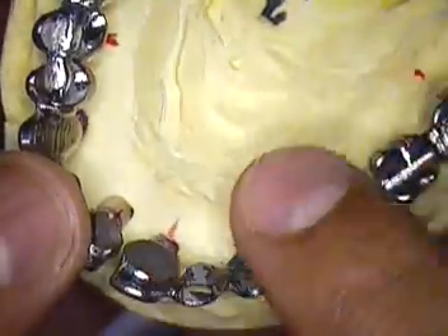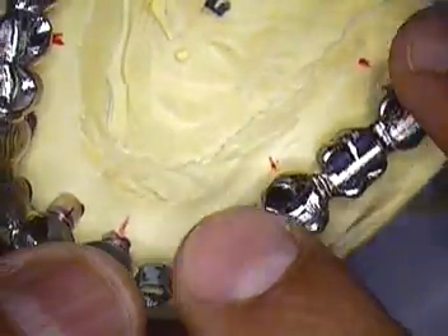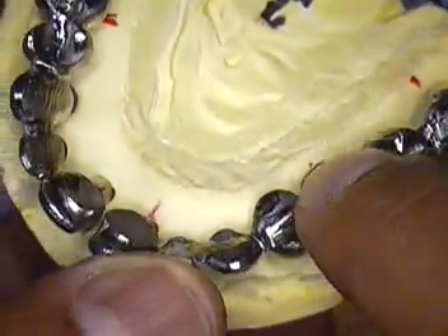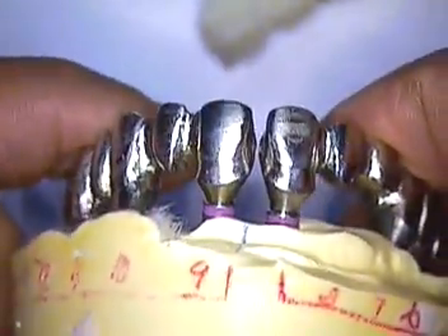Two things to verify today: first, fit — making sure that these two spans are fitting passively in the mouth as they are on the model. And number two, bite registration verification. We also need to select our color as well.